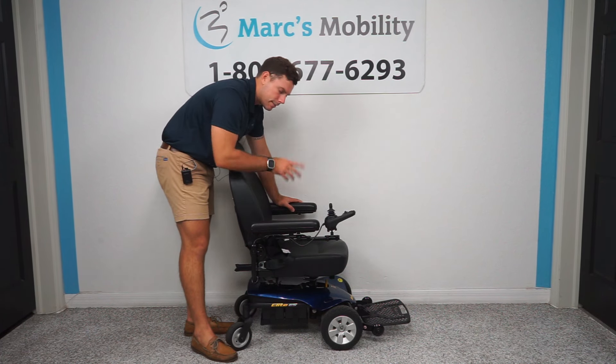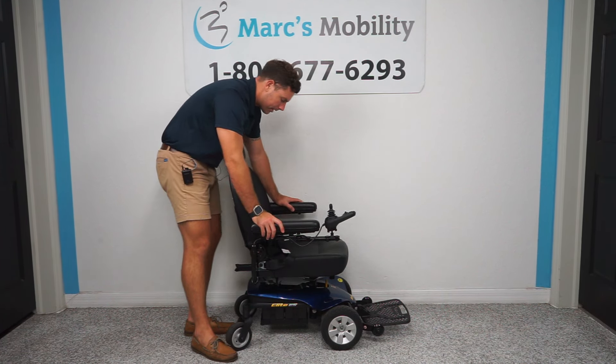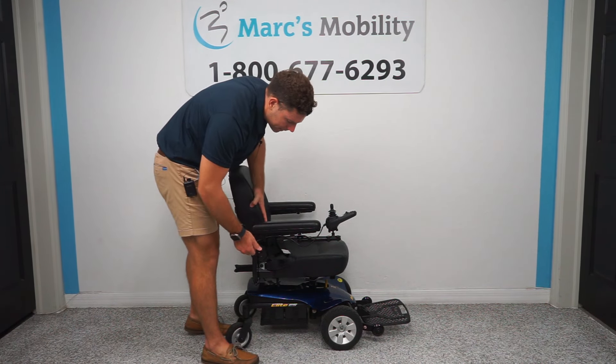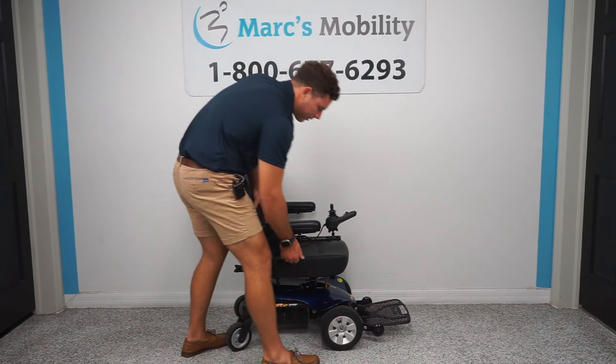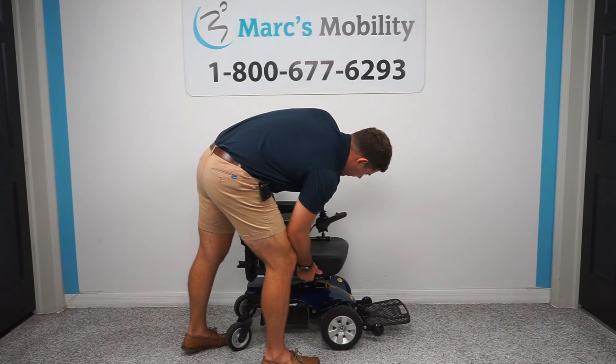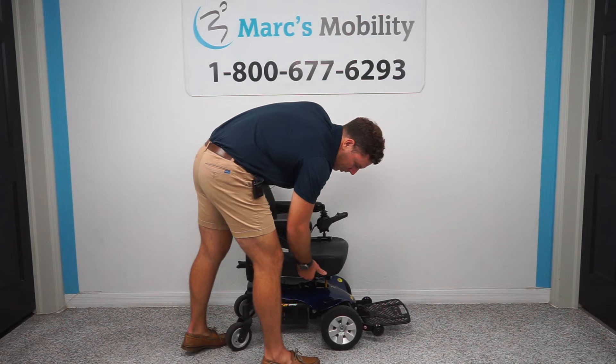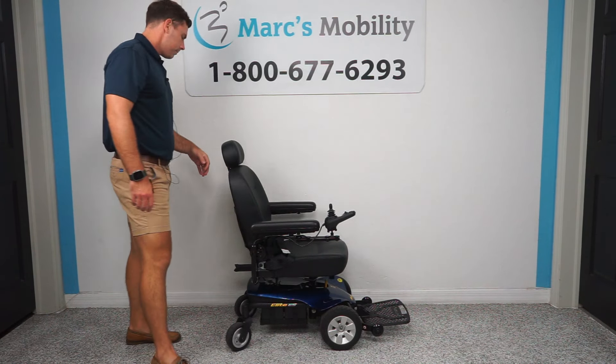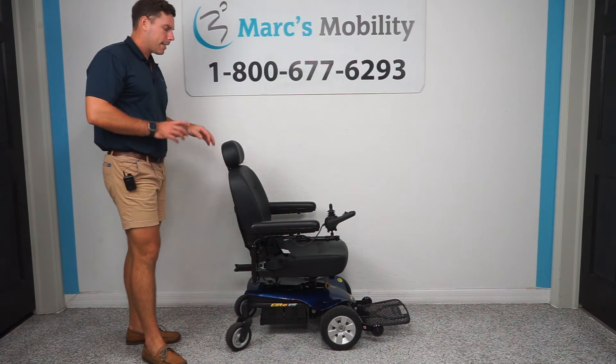The joystick can also be put on the left-hand side for left-handed users. It comes with a seat belt, and it has a little bit of recline with a spring-loaded handle. This unit also has a swivel seat — if you hold the lever, you can swivel it, and it locks every 45 degrees.